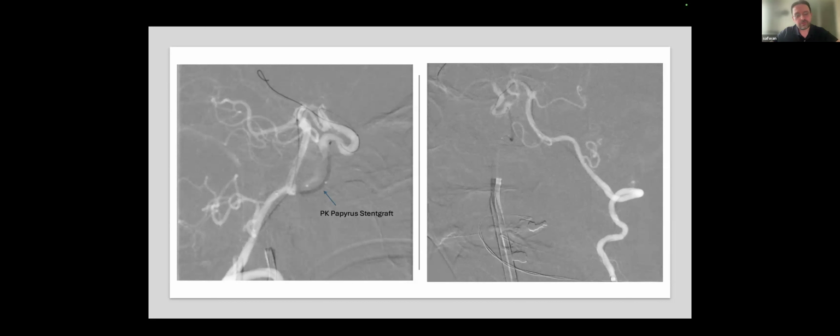We did do 3D imaging, but with our device it wasn't that helpful, to be honest. The flow was so high that I was not able to decide exactly where the hole of the carotid artery was. There were many small holes, and when I tried with the wire to go up from below, the wire was just swimming in the cavernous sinus. There were different U shapes, and sometimes I first tried without a U shape, but with the U shape it was going completely inside. It was amazing how big and extensive this laceration was.